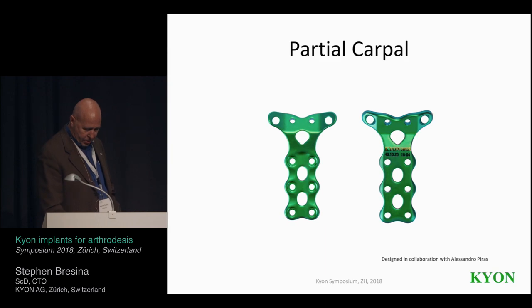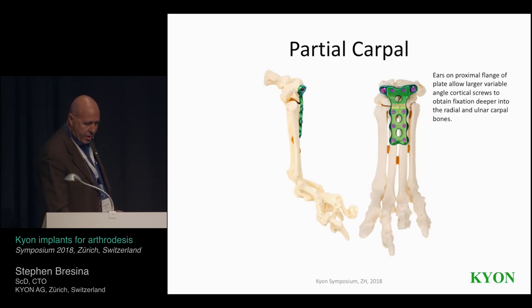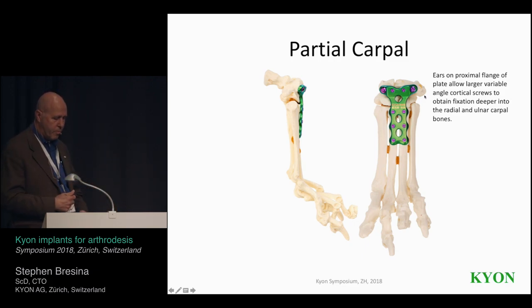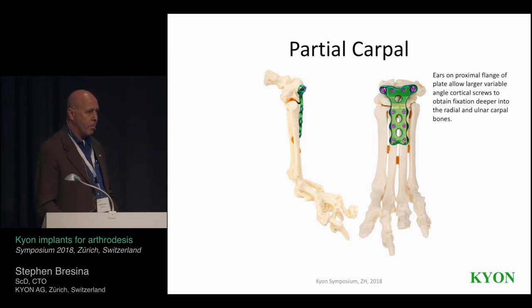So then, based on the same kind of distal shape of the pancarpal plate, we came up with the design for the partial carpal plate. Basically keeping the same distal component, and then adding to it this flange on the proximal end that allows some ears with larger holes so you can put some variable angle screws in there to get a good bite into the radial and ulnar carpal bones.